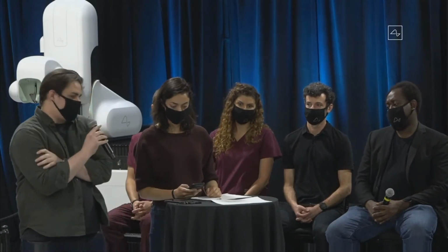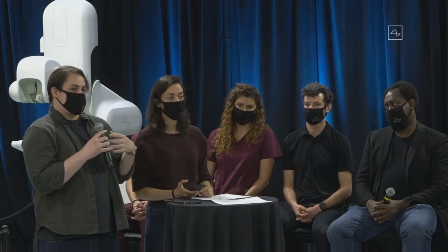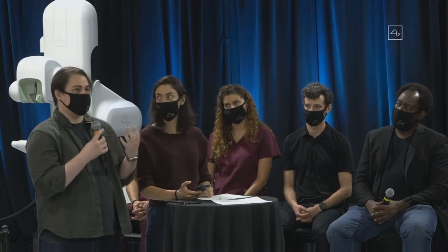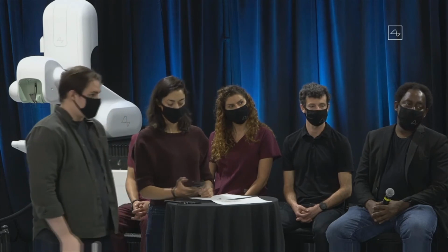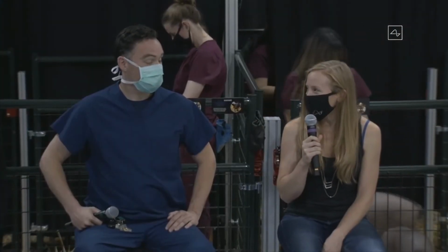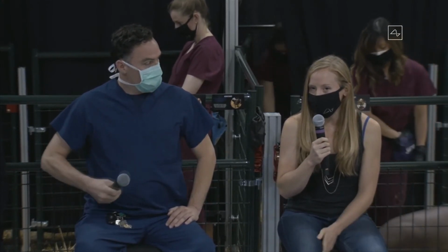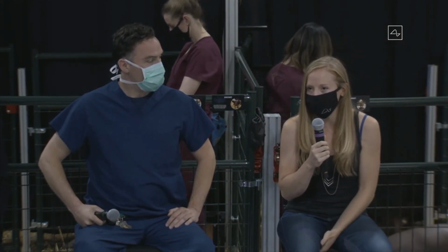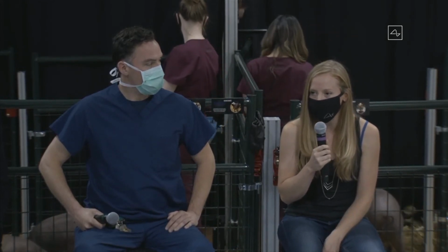So here's another question about the integrity of the device, more from a mechanical perspective. You're replacing a piece of bone with an implant, and then the person is going to take that home. How does the integrity of the device fare compared to, I don't know, bone or something similar? Sure. Well, I think Matt's probably replaced a lot of pieces of skull with plastic and other materials, so I don't know if you can talk about some of those. But basically, we know the mechanical properties of bone, and we know what the stresses on the device are going to be. So it's fairly easy to go from first principles and design for any condition that it might see.